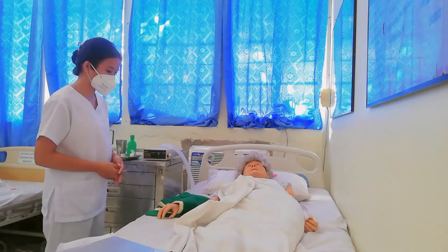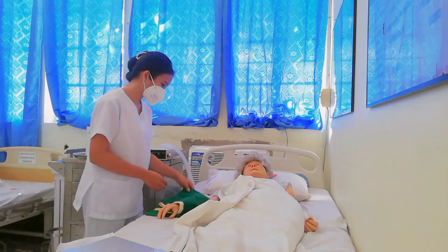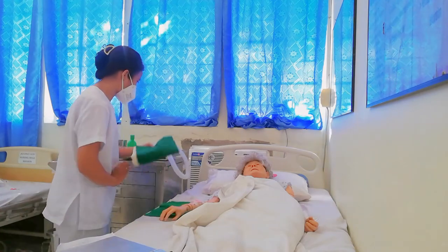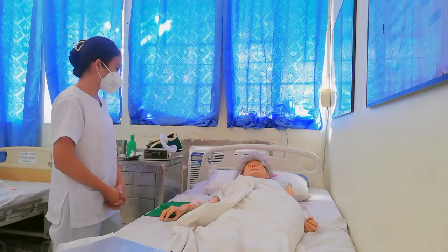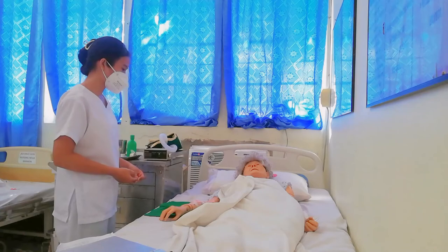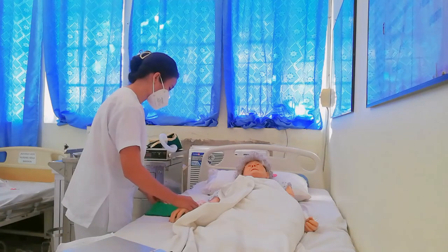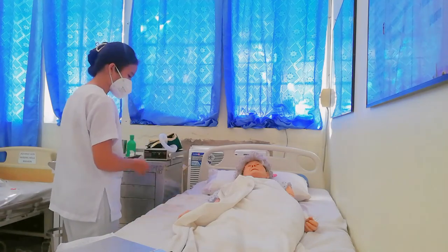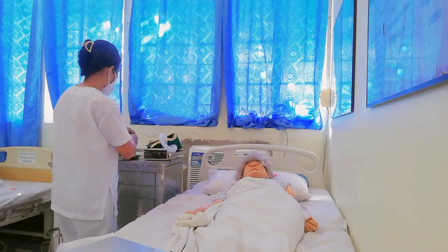The 15 minutes is now finished. I'm now going to remove the device and reassess your skin for any redness. How are you feeling, ma'am? Are you more comfortable right now? Does it lessen the pain? I'm going to remove the waterproof pad. I can see that there is no redness. I will perform hand hygiene again.